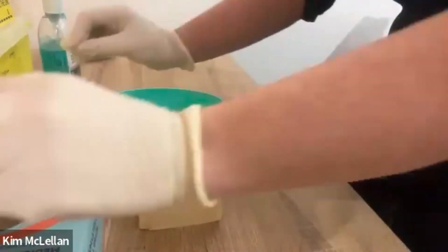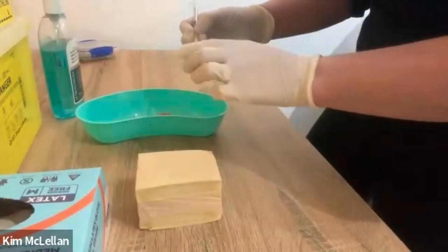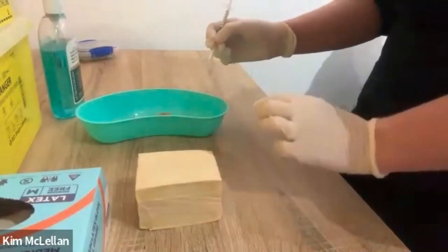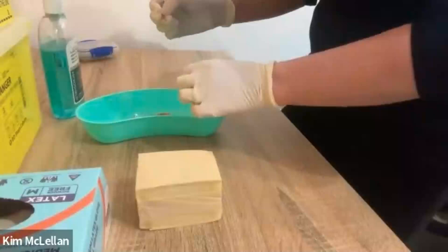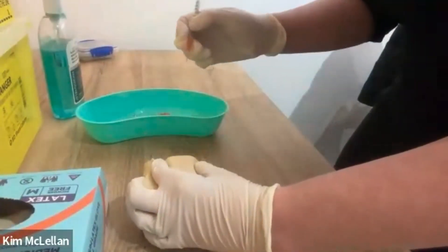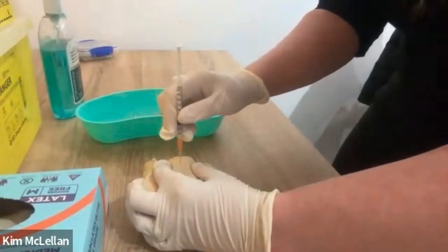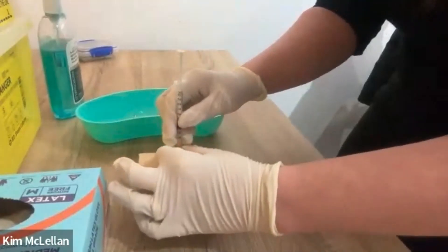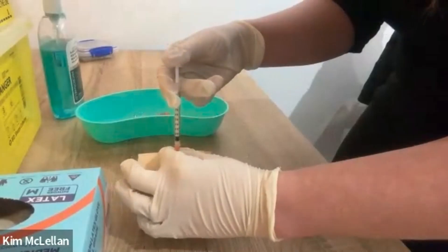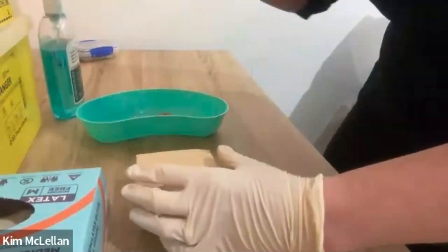I'm just going to lift up your top. I'm going to make sure that we administer the injection five centimeters away from the umbilicus. You have plenty of subcutaneous tissue there, so we're going to administer it at 90 degrees. I'm just going to pinch the skin and administer the injection now. Straighten, let go of the skin, let that relax, and then slowly administer the insulin, straight out and into the sharps bin.